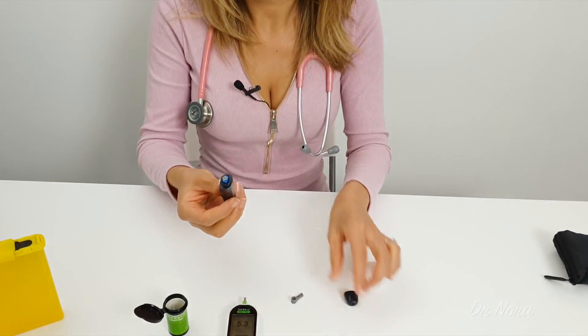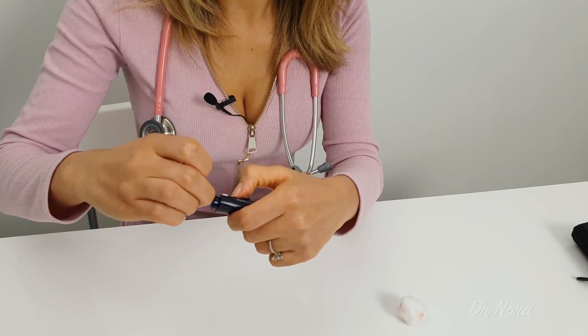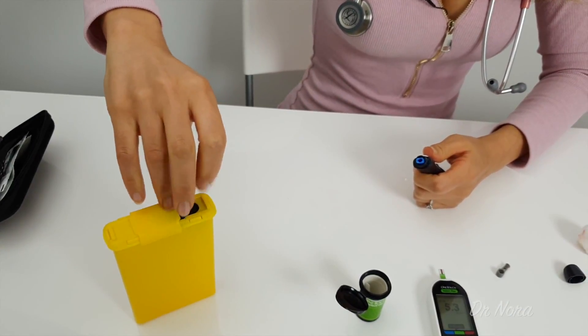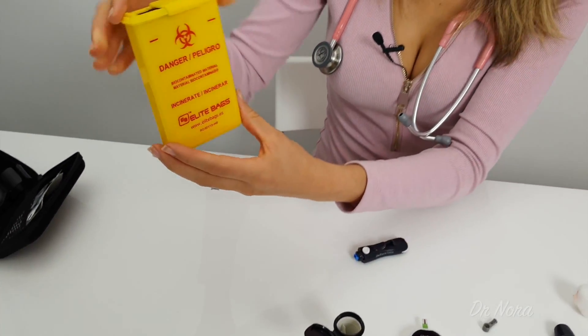After you've done that, you need to dispose of your needle in the sharps bin. Unload your lancet device, take out your needle carefully, and place it in your sharps device. As you can see, this has got 'danger' written on it. It's really important that no children put their fingers inside the sharps device because it does contain sharp needles. This will help the prevention of any blood-borne viruses such as HIV or hepatitis. Once your sharps device is full, you can give it in to the pharmacy and get a new one.